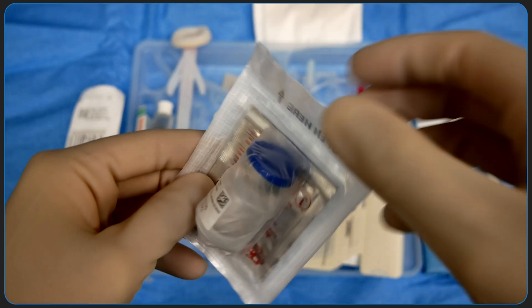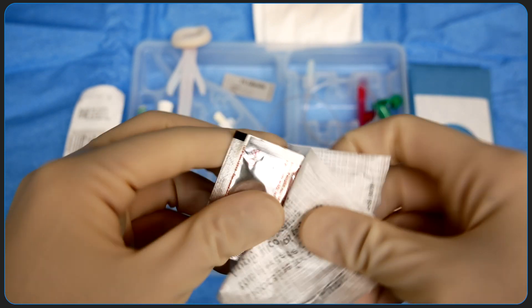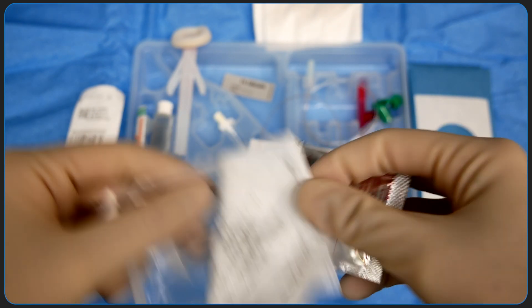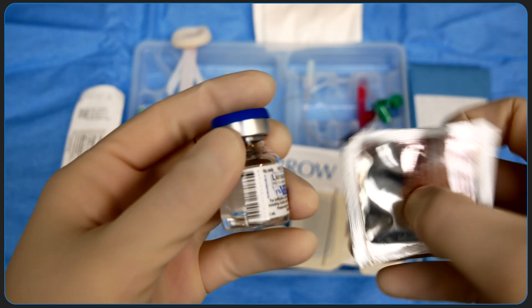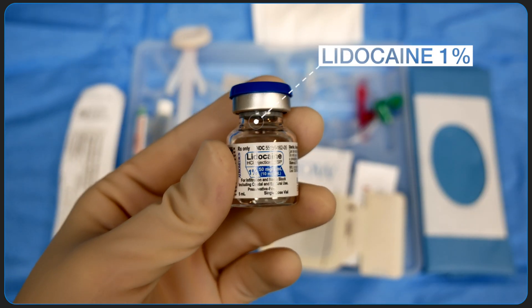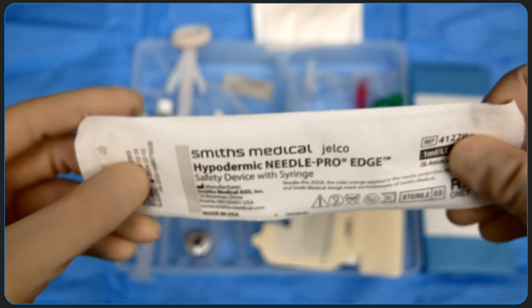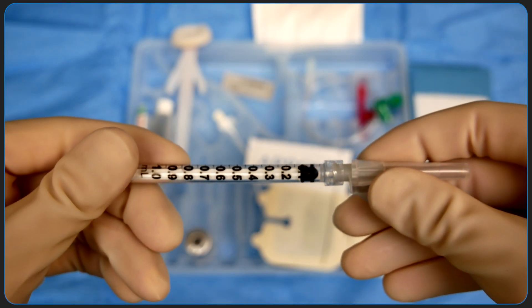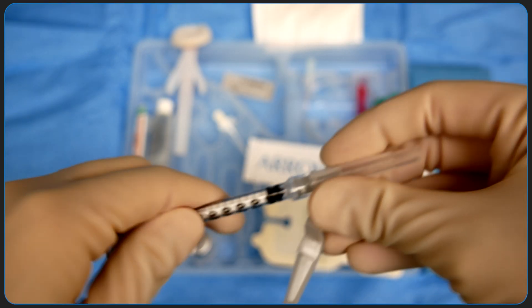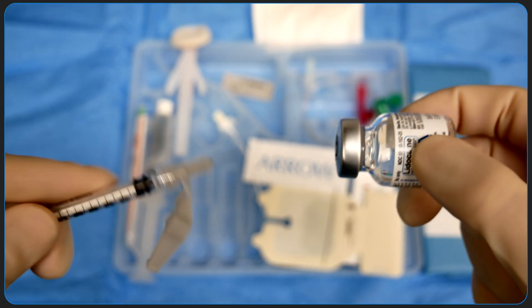Before I insert an arterial line I always anesthetize the overlying subcutaneous tissue with lidocaine. This kit includes a bottle of 1% lidocaine and an alcohol swab for cleaning the bottle. I usually inject about a half cc to a cc of lidocaine subcutaneously using a 27 gauge hypodermic needle. You can fill the syringe using a separate blunt tip or just save some time by pulling the lidocaine directly through the hypodermic needle.